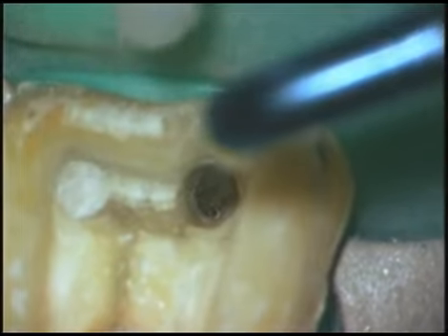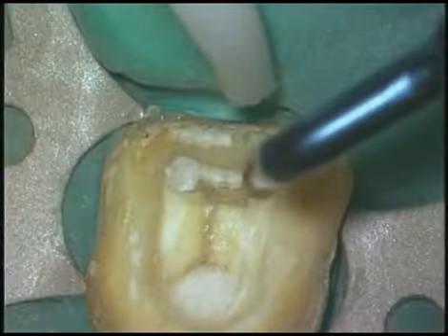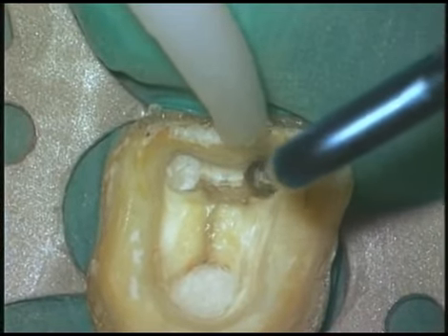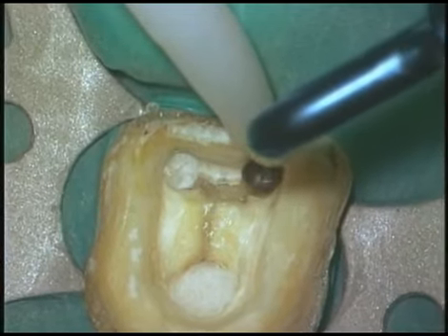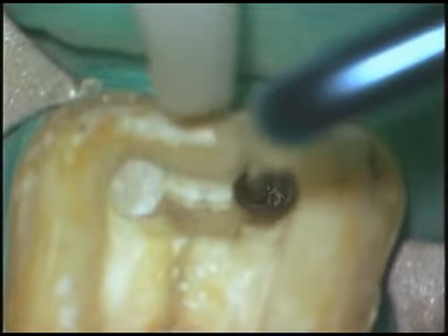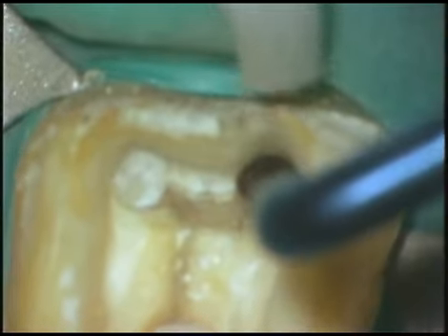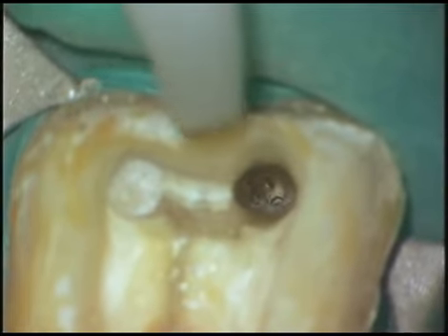We need to be very mindful of external root anatomy. In this case, we don't take the ultrasonic instrument circumferentially around the fragment because that would weaken the tooth or predispose to strip perforation. As we vibrate just basically directly on the head of the broken instrument, sometimes this will loosen it and it'll kick the instrument up and we miss its departure.